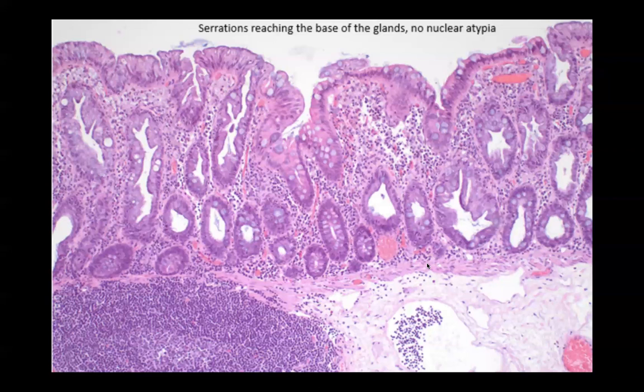You have nicely demonstrated that the star-like appearance of the crypt opening can be recognized down to the muscularis mucosae. But I haven't seen the boot-like, dilated appearance of the crypt bases. Is this obligatory or not?